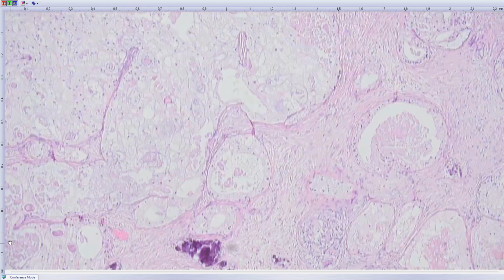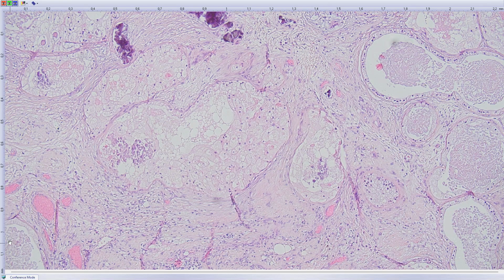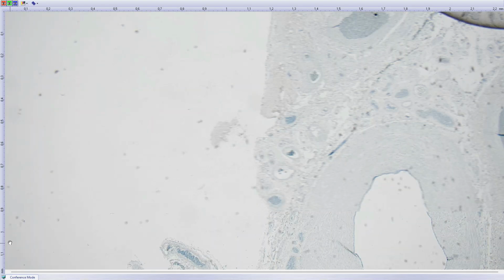But as Michal said already, this was a metastasis of prostate carcinoma, but it was not very straightforward. When we excluded all these options of primary testicular tumors, we then moved to the option that this could be metastatic carcinoma.